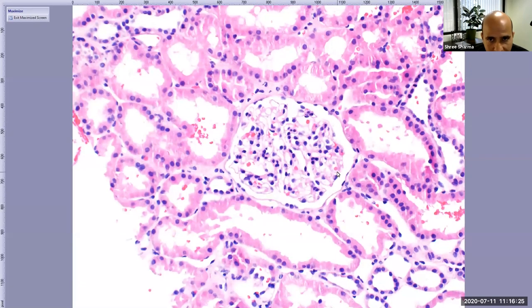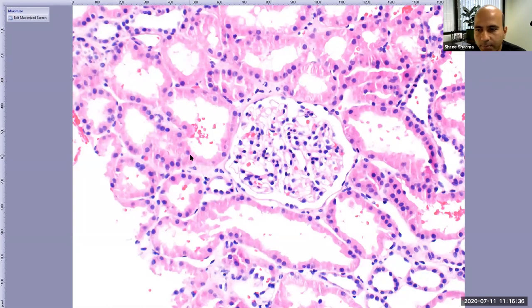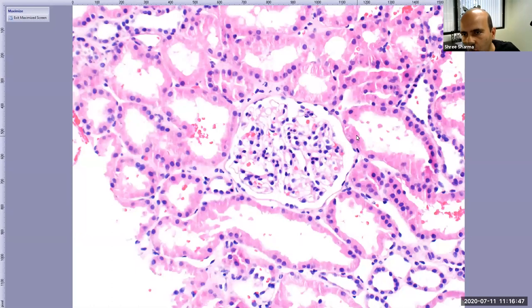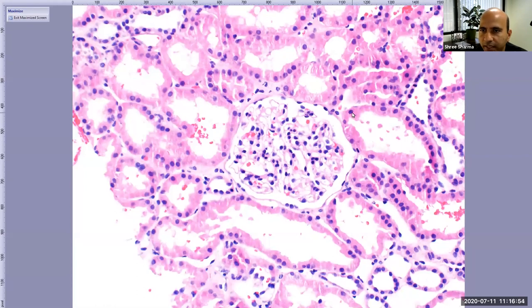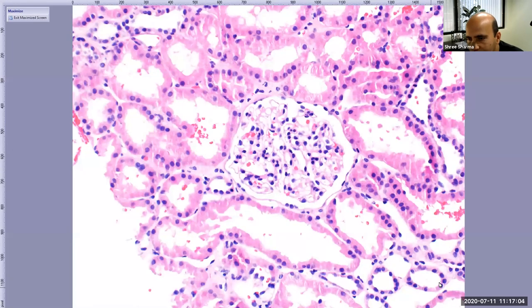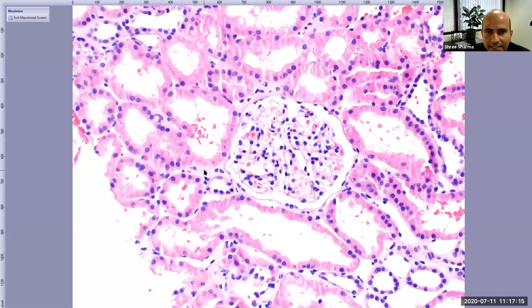As I go out of the glomerulus, I start focusing on the tubular structures outside. These pink structures are known as proximal tubules. How do I know they are proximal tubules? Proximal tubules have pink granular cytoplasm — the granularity is the coarseness of the cytoplasm, like small pink structures. Whenever you see tubules with a lot of pink cytoplasm, you know that is a proximal tubule.